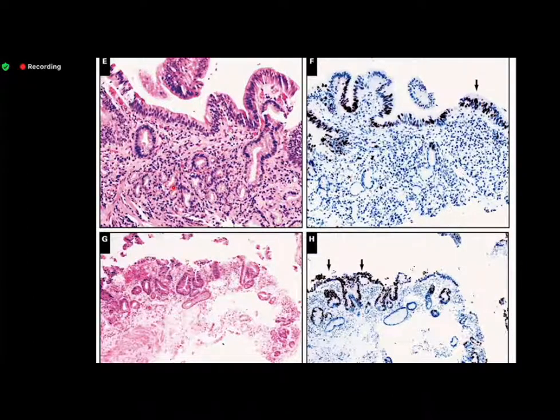So picture E again represents a Barrett's esophagus with a little bit of surface atypia, and in the concurrent IHC, we can see Ki-67 that has surface expression. Again, based on this, we would think about a possible dysplasia, and the outcome was progression in this case. Picture G shows another utility of this marker, where we can see some denudation of the epithelium, and whatever was left in the residual epithelium showed increased surface Ki-67 expression, and the outcome was progression in this case as well.